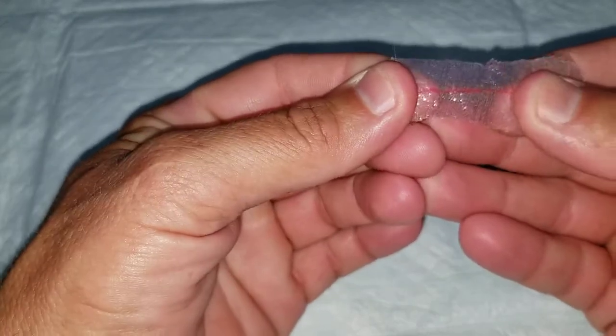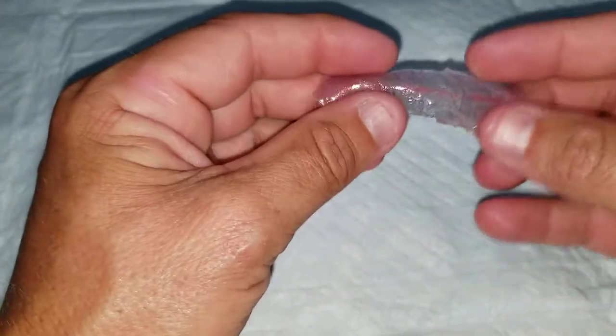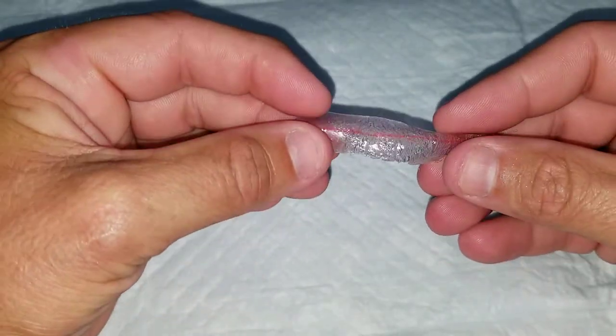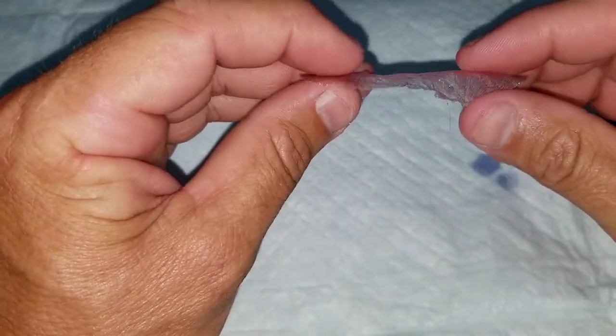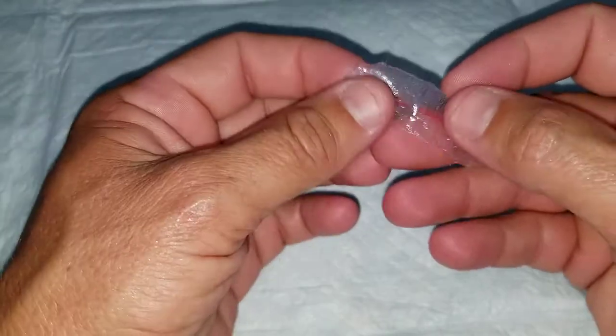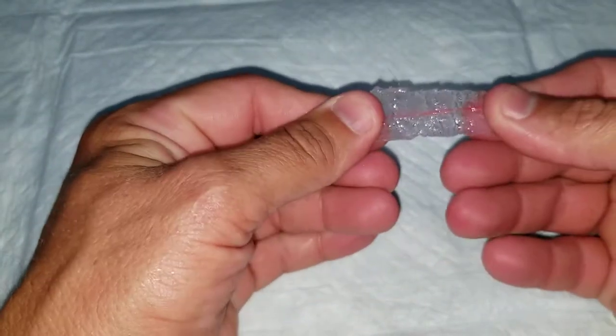As you can see from this, it's like plastic pretty much. It's very flexible. You can see it stretching. And this is fine, this is pretty thick. You can see the shimmer in it from the camera light. But this is a good example of why you don't want to put Exofin tissue adhesive on too thick, because if you do leave it thick on the edges, it's like a scab. You can pop it up, and being almost like a stretchable plastic now, you can remove it.